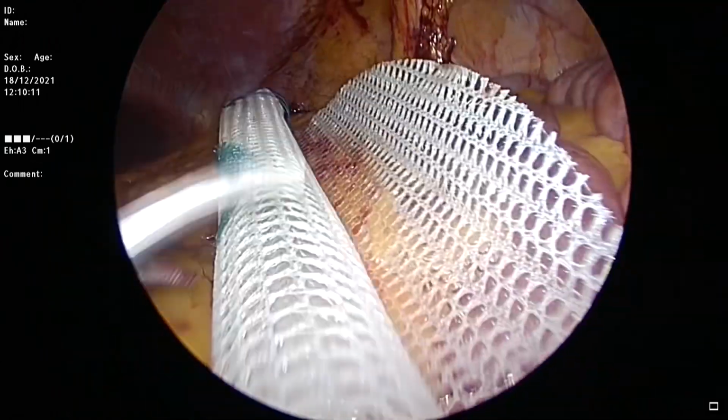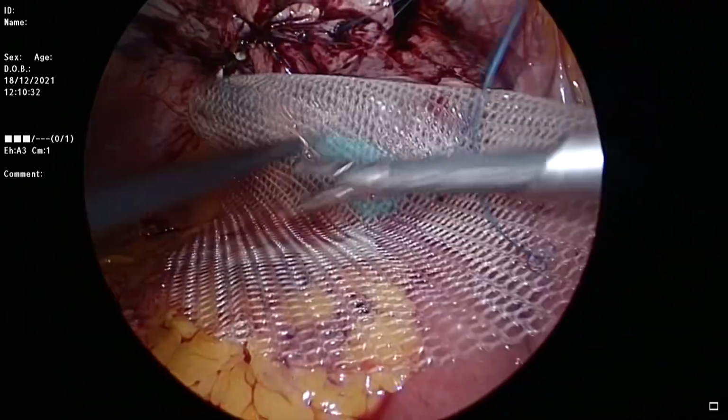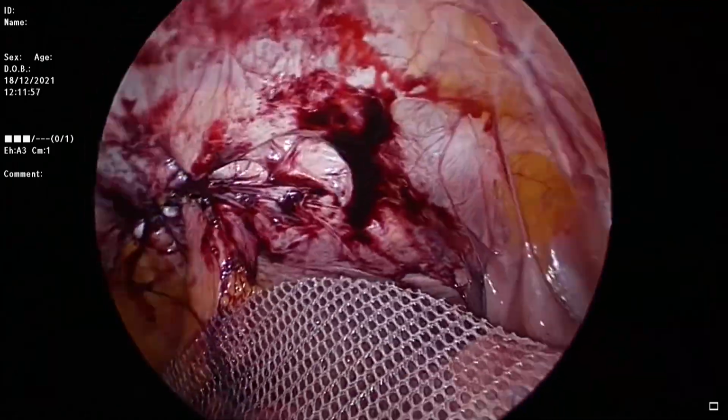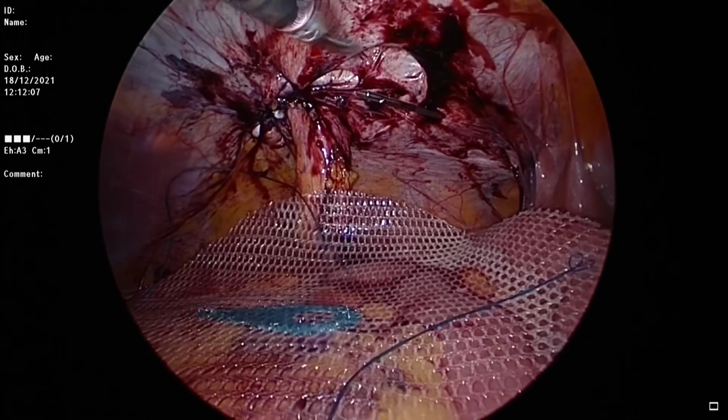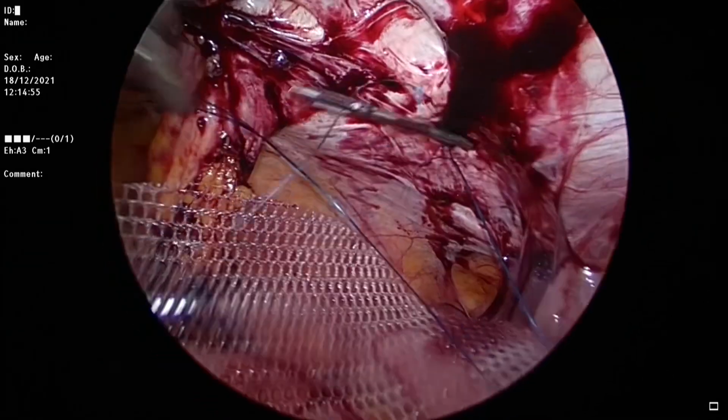The Symbiotics 15 cm composite mesh is taken inside the 10 mm port. After opening up the mesh, the parietal and visceral layers are identified and fixed using the prefixed sutures transfascially.